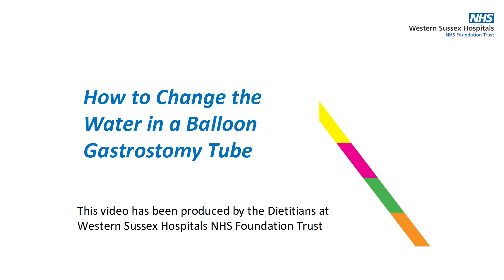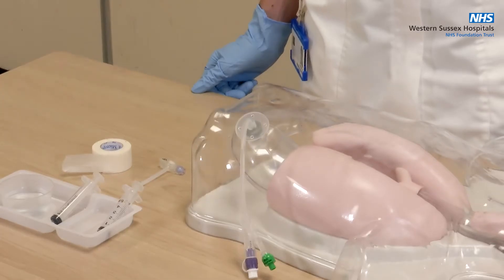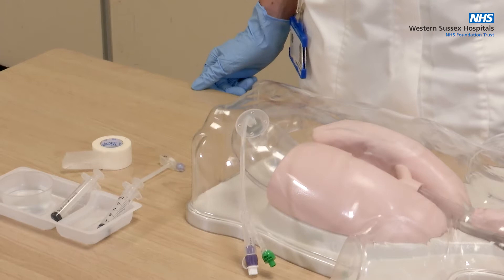This video demonstrates how to check and change the water balloon in a balloon-retained gastrostomy tube, either a G-tube or a button. This procedure is usually carried out once per week or if you suspect the balloon is compromised.